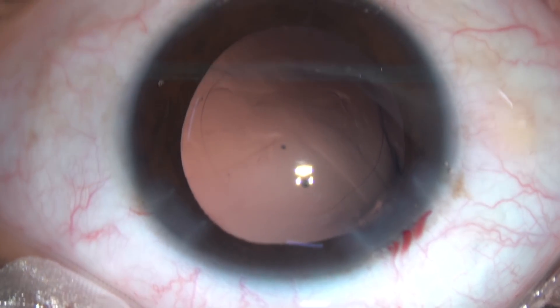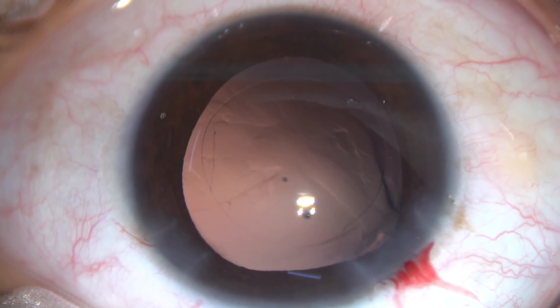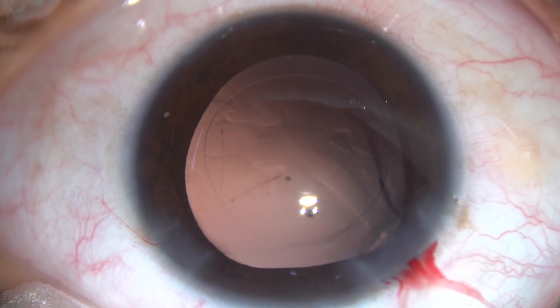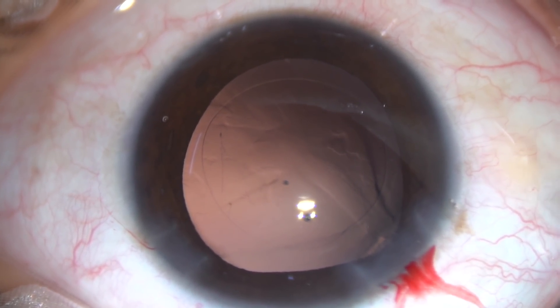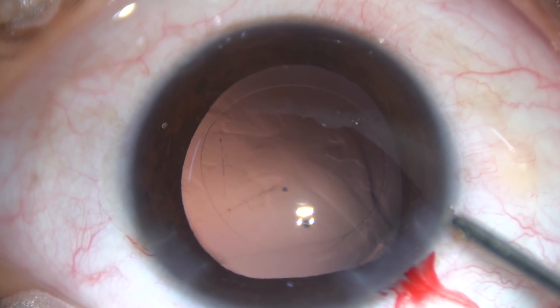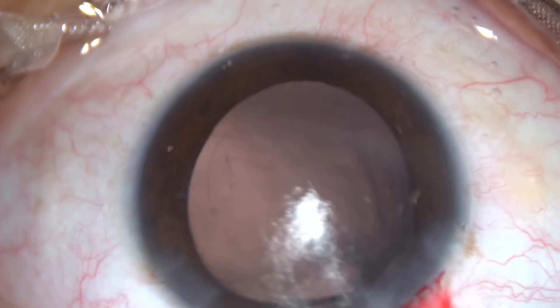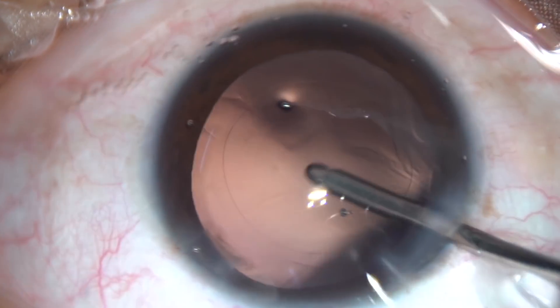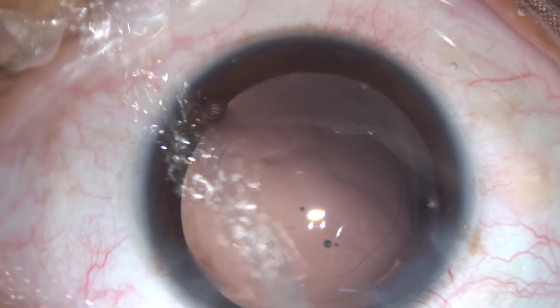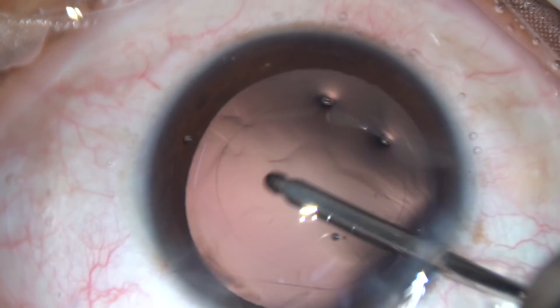Since this is a 20-year-old patient, I have advised her that she will need a YAG laser capsulotomy in a few months. Some more polishing is now being performed using the irrigating jet of fluid, which is swept over the posterior capsule to achieve further polishing.